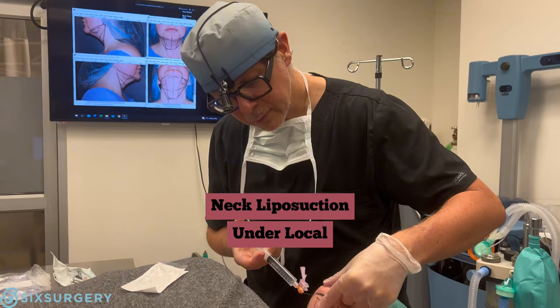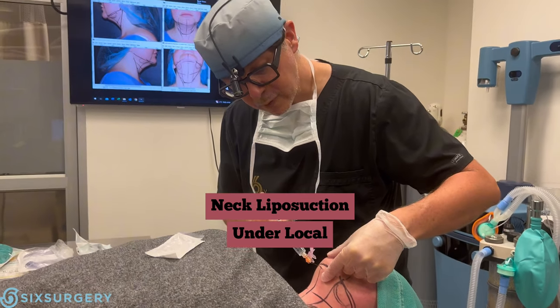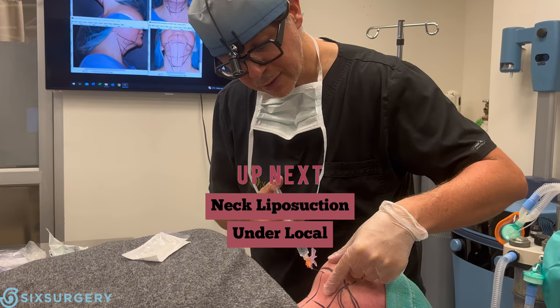Are you ready? Okay, here comes a poke — one, two, three, poke. So we're freezing going in. We're going to freeze this whole area so it's going to be completely numb. She's not going to feel anything once the freezing goes in. Right now it's going to sting.